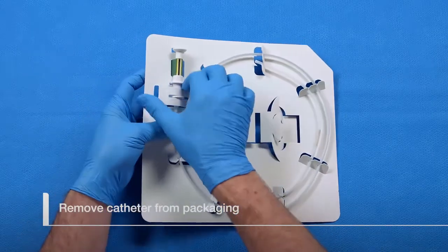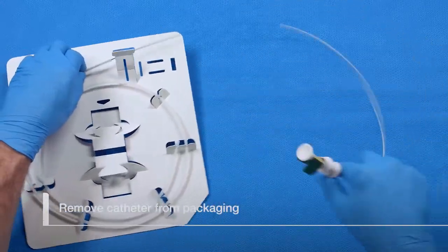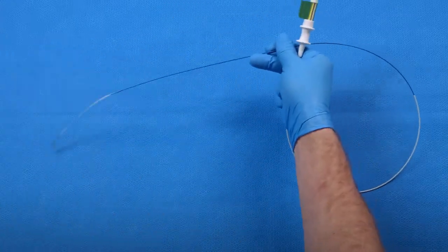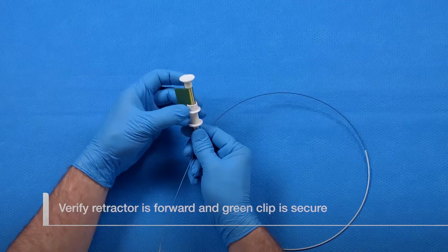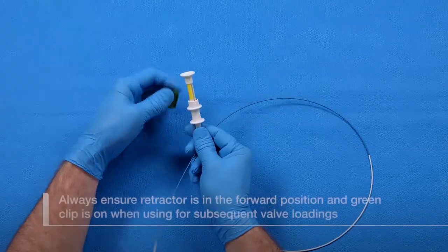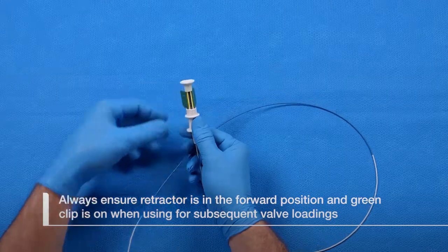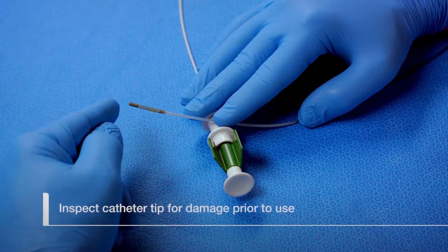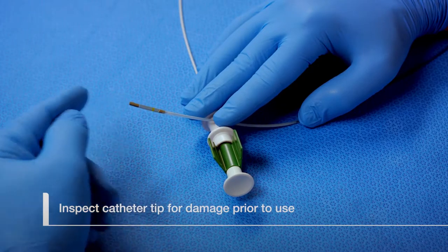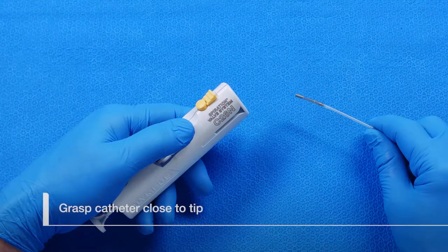Remove the catheter from the protective tube in the packaging. Verify the catheter retractor is fully forward and the green safety clip is installed over the yellow portion of the handle. This is very important when reloading the catheter for subsequent valve loading. Inspect the catheter's distal tip for damage prior to inserting it into the loader.